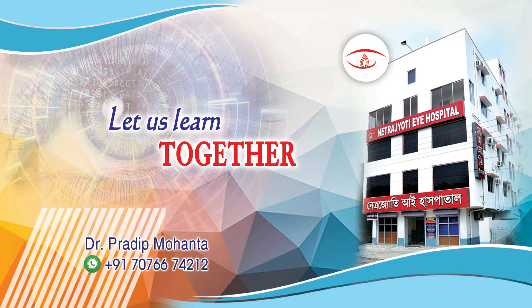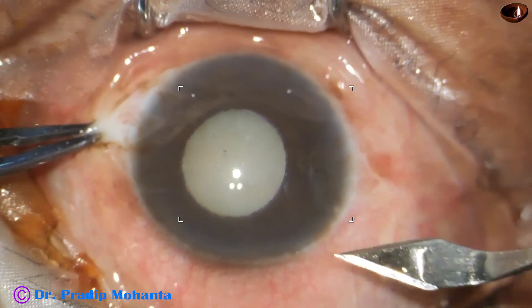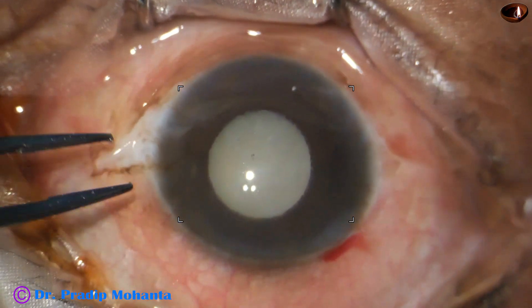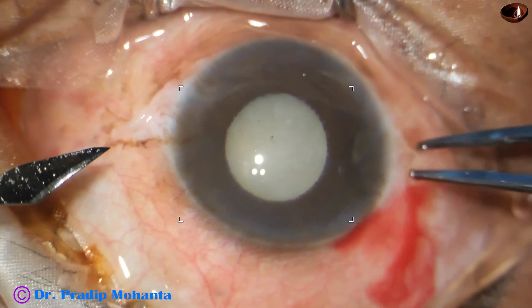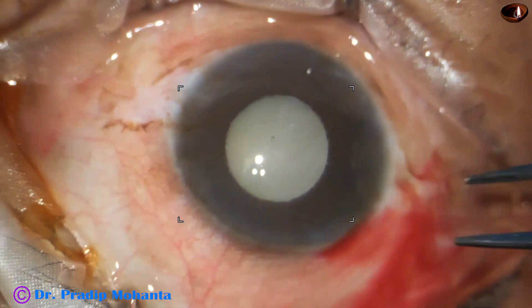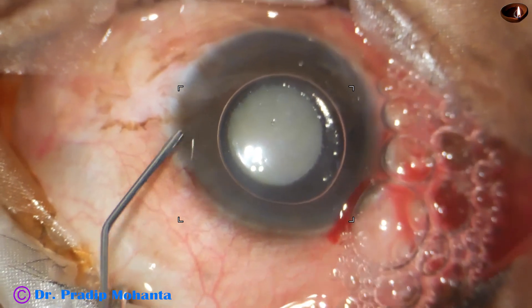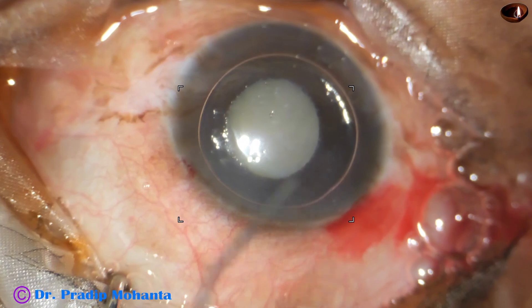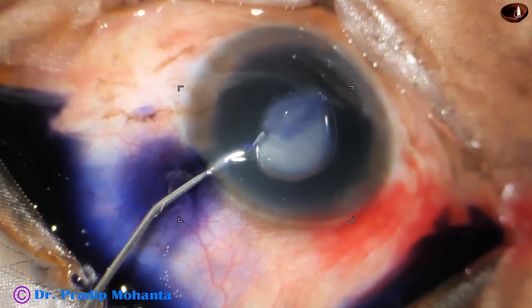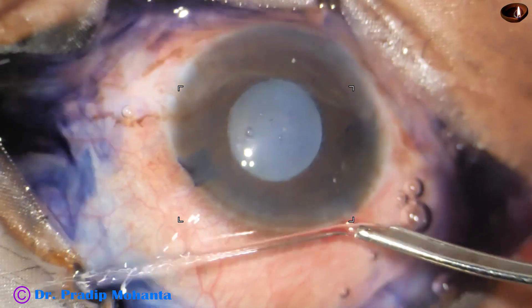Friends, welcome to my workplace at Ranaghahat, West Bengal, India. Let us observe this surgery. The patient has come with high intraocular pressure — 50 mm of mercury. This is a hypermature morgagnian cataract, and in my opinion the case is going towards phacolytic glaucoma. I have taken up this case for surgery with medications to reduce intraocular pressure. The pressure came down to 30 mm of mercury, and I have taken up the case for surgery.